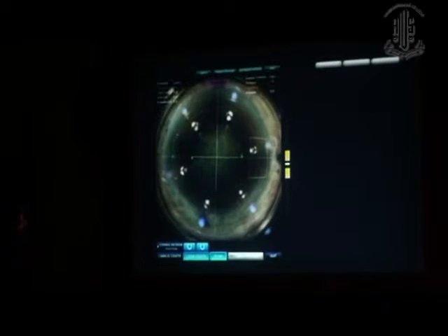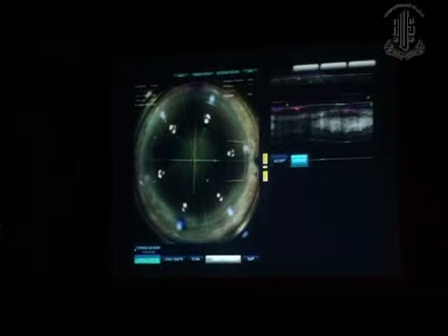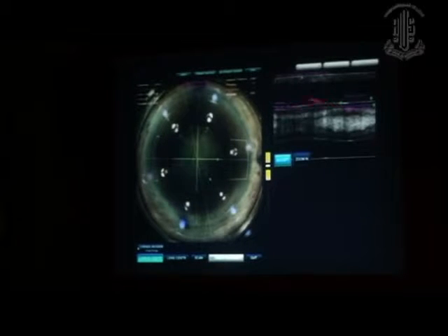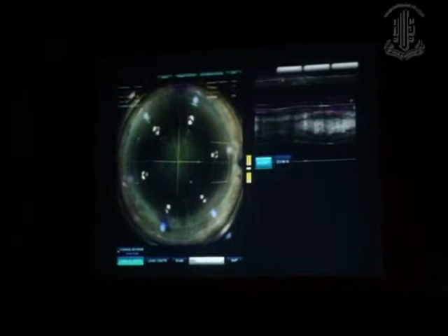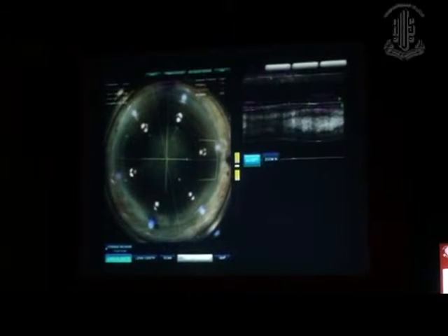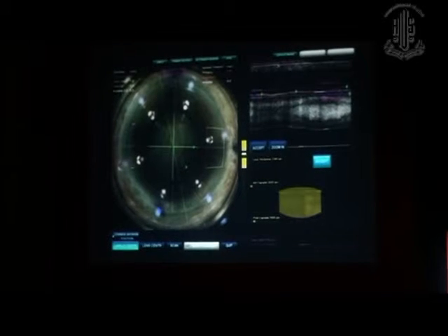Now, as we keep looking at this further, you will get an OCT image. This is an OCT image that is thrown up. This is the anterior capsule on the OCT. There are 2 points which have to correspond to the highest and the lowest point of the capsulotomy. Can you see this? So we have matched this, and you will get a contour curved capsulotomy which is going to give you a circular capsulotomy. This bar has to be on the green, and you can see we have brought this to the lowest point. This is the highest point. This is actually real time.